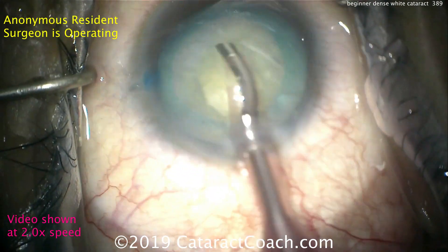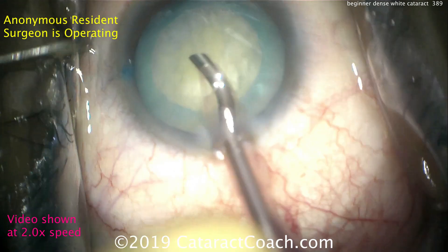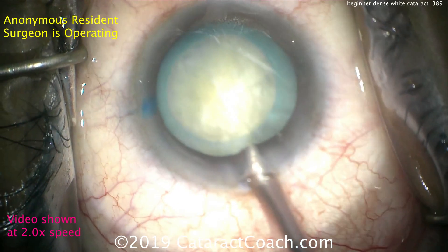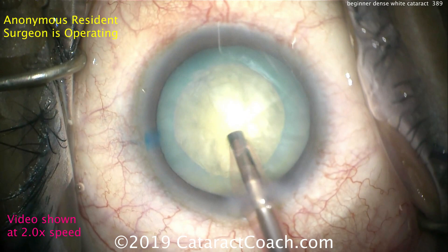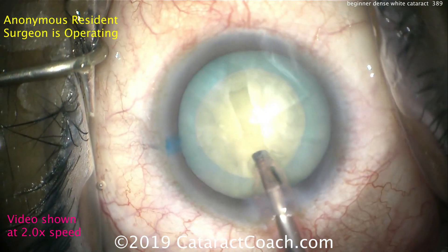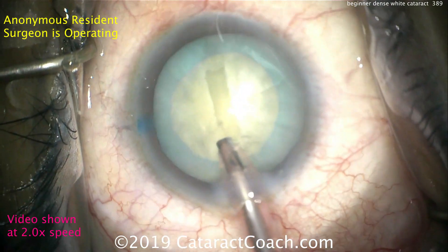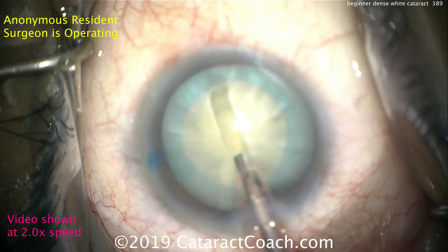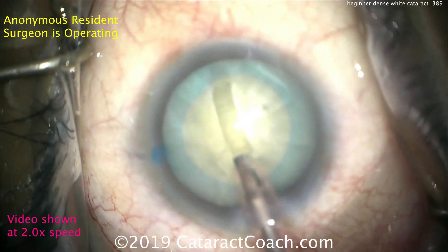We don't have the phaco settings. Let's try to get this eye back in primary — the eye is drifting towards the nasal canthus. Looks like the surgeon is sitting temporally. For some reason the probe came out of the eye. Let's go back in. Now it's bevel up. Groove, another groove — looks pretty good. I'd start the groove a little bit closer to the sub-incisional area. You can groove it a little closer there, and groove deeper then flatten out, just up until that rexis edge. Grooves are looking pretty good here.